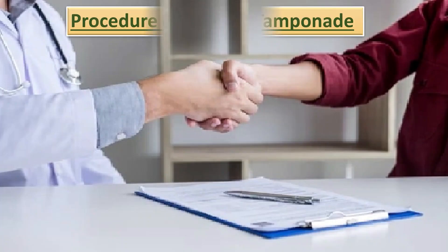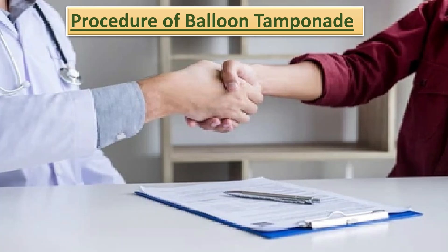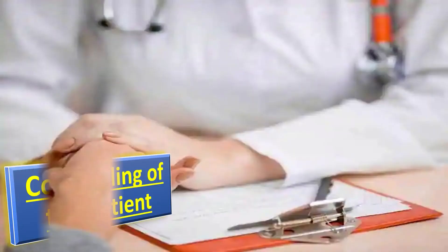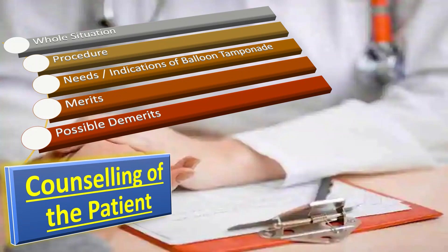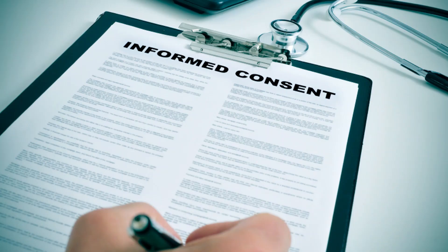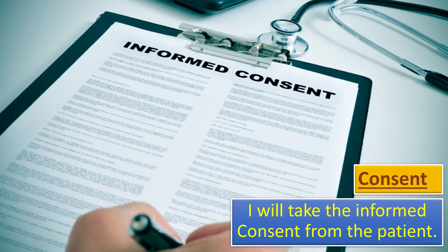The procedure of balloon tamponade starts with introduction. First, I will introduce myself to the patient and attendants. Next, I will counsel the patient by explaining the whole situation, the balloon tamponade procedure, its needs, its merits, and its possible demerits. Then I will take the informed consent from the patient.